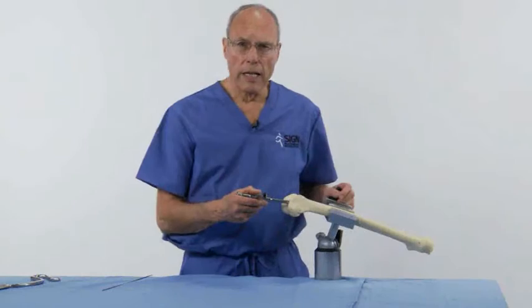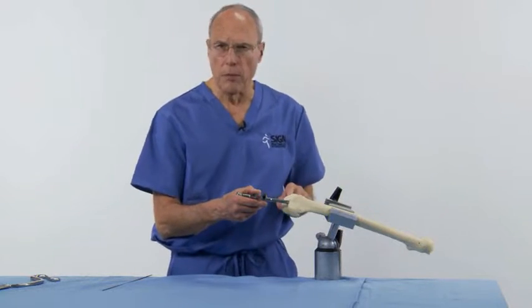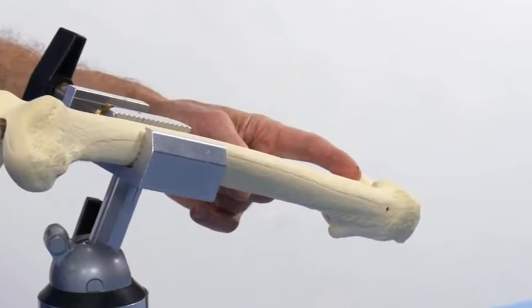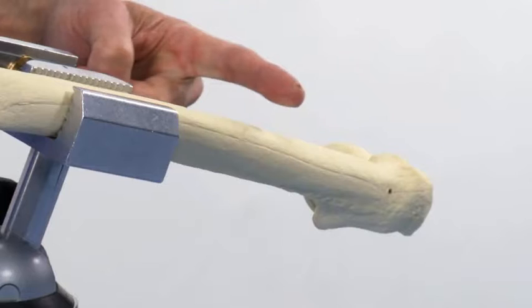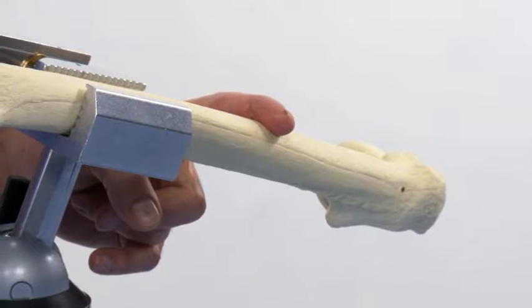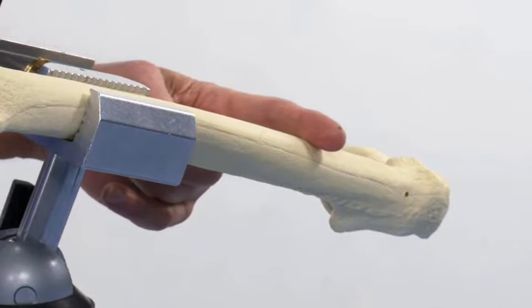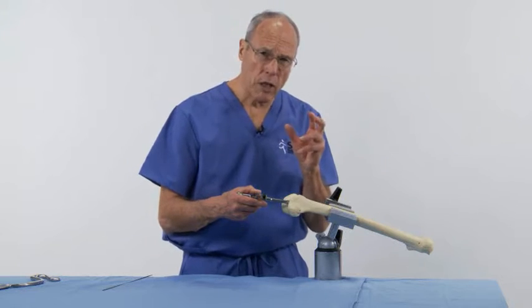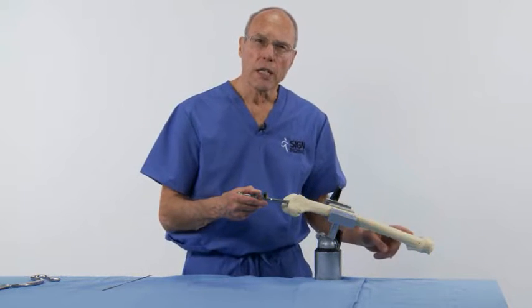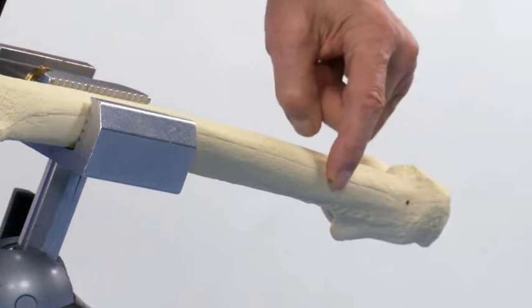I'd like to make 2 points about stabilization of the femur through the retrograde approach. The first point is the length of the nail. Ending the nail at the lesser trochanter or 4 centimeters distally may result in fracture of the femur later on if the patient has subsequent trauma. This is the high stress area of the femur. The stress comes from the interlocking holes, and the stress comes from the end of the nail. It's really bad to leave an unfilled hole in this area of the femur.